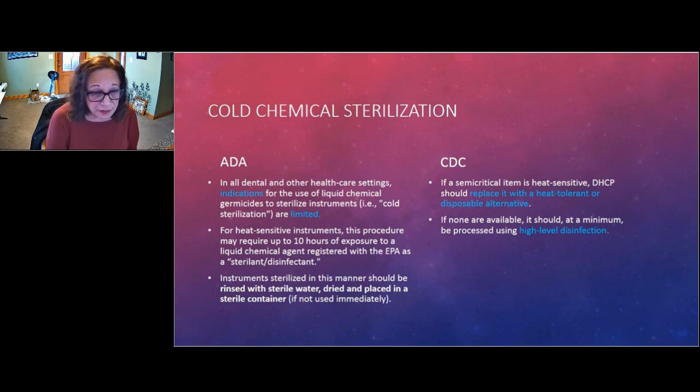CDC, on the other hand, says, well, if it's heat sensitive, pretty much replace it or get a disposable. Replace it with something that can be sterilized or get a disposable alternative. And then if there's no disposable alternative or no heat tolerant alternative, then you should, at a minimum, use high-level disinfection.